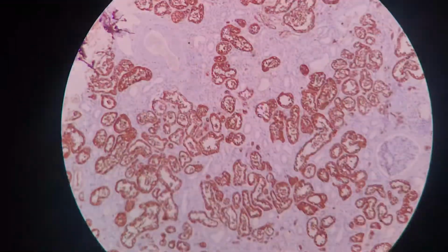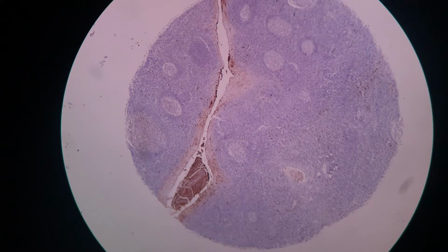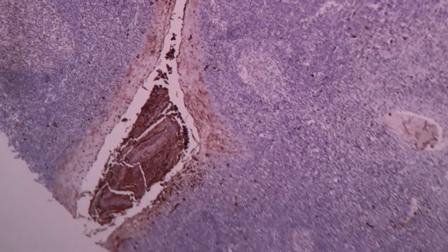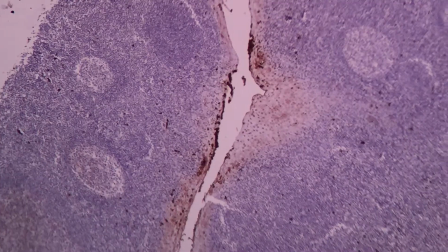Now let us check the tonsil. In tonsil, there is a scab which is getting stained. The scab is made up of granulocytes and proteinaceous material, so that gets intense staining, so that is to be ignored. Such scabs can be seen in tonsil which is infected.